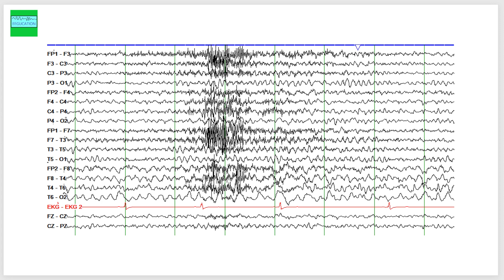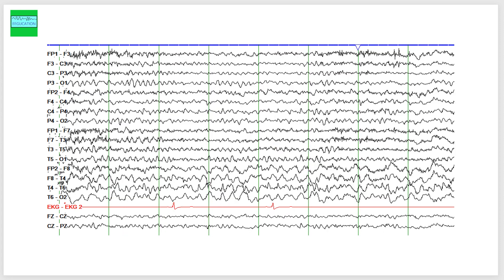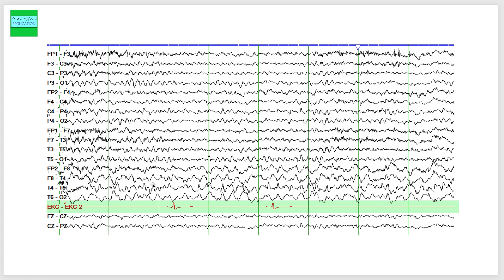Now looking at the next page here, the asymmetry is way more clear. You can compare the left side, left temporal region with the right temporal region, and then also look at the ECG. What we are seeing on the EEG is actually an electrographic seizure. Electrographic seizures do not always present with spikes or sharp waves. Sometimes you can have this polymorphic slowing that comes out of the blue. It has a beginning and it has an end, as we will see. And sometimes this change in the EEG is what triggers a change in the ECG.